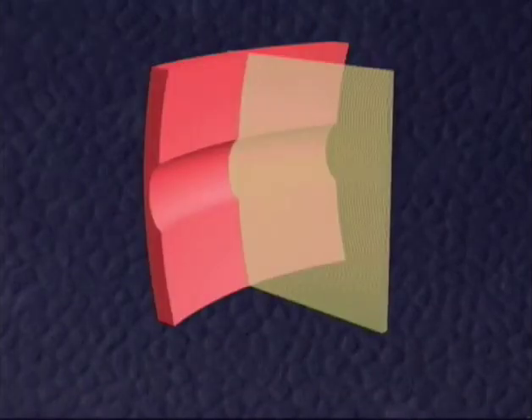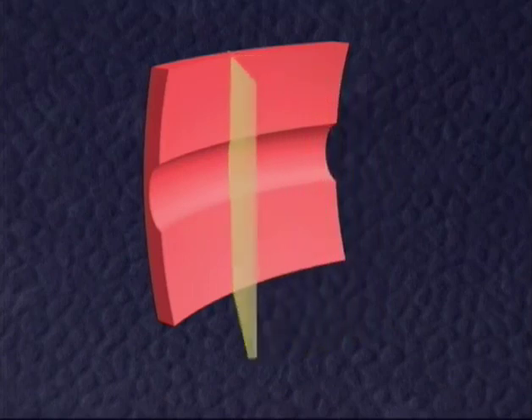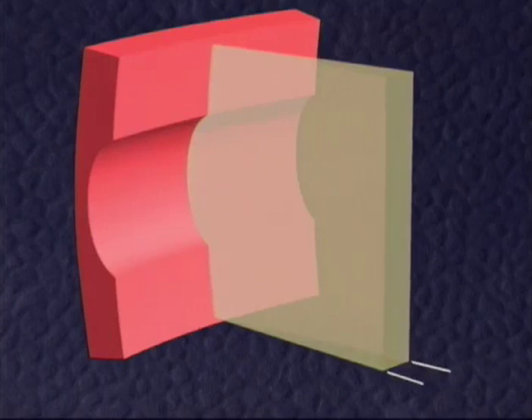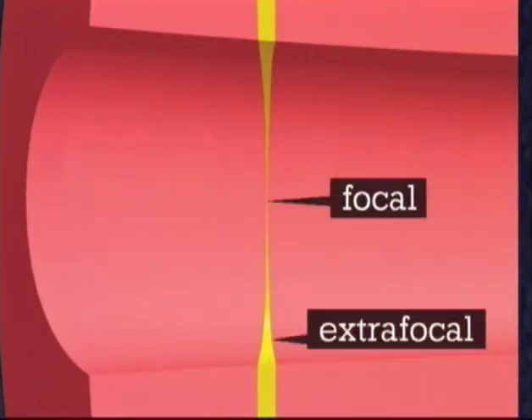The narrow slit light, when precisely at focus, is a fine line which reveals a clean profile of different levels. But the outlines of this profile are only seen well at the large angle of illumination. At a small illumination angle, the slit image tends to become straight, whatever the shape of the profile. Instead of its contour, also differences in the width of the slit image can be used. The differences in width remain recognizable even when examining with small angles of illumination. At the level right in focus, the beam will be narrow, while at levels met by the extrafocal parts, the beam will cast a wider light strip.